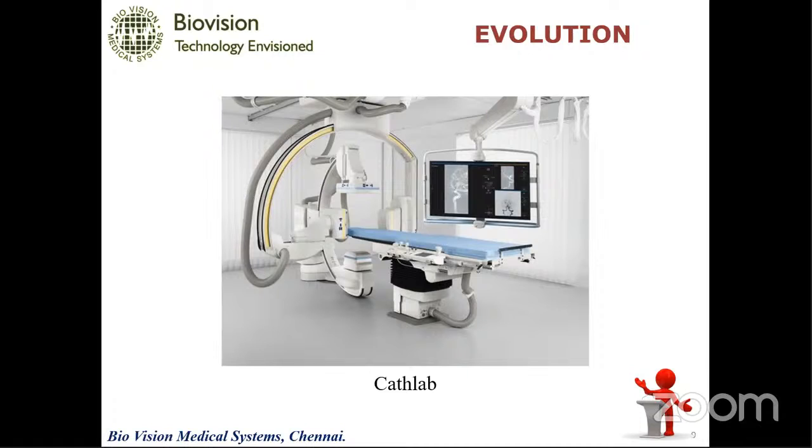When I say it is a C-arm, I can slide the C. Okay. But I cannot move it very easily. It is portable, you have wheels, you have to move it somewhere like that. But here it is remote operated, where you can move it however you like. A cath lab is a hanging C-arm, a ceiling-hanging C-arm kind of thing. I think you can visualize what it is. So it is a ceiling-hanging C-arm which can move around throughout.